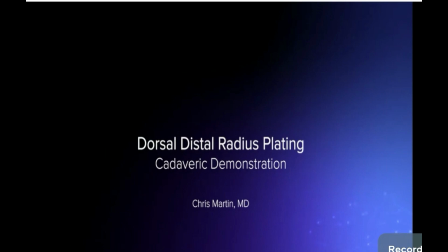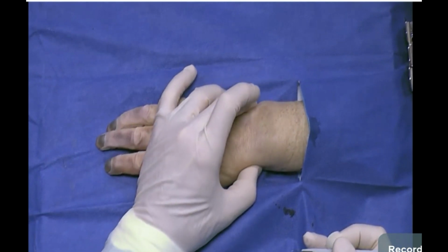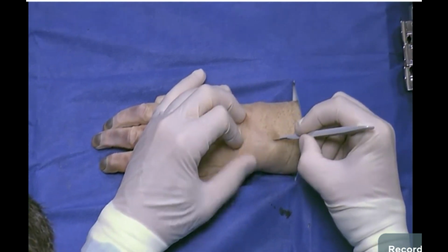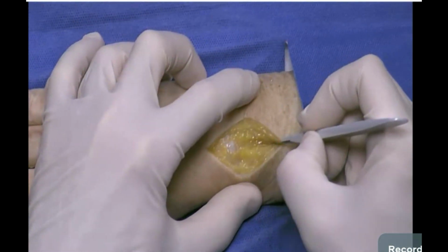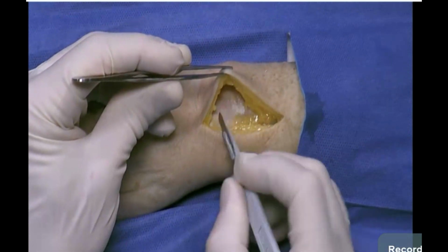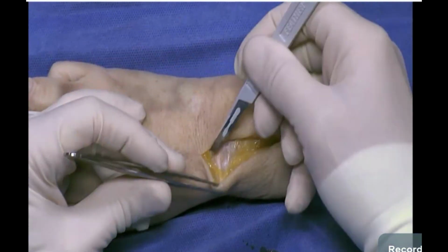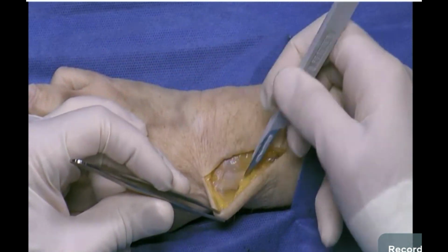So we're going to do a dorsal approach to the distal radius. The first landmark used is generally the styloid and Lister's tubercle. And we're going to come in straight over the carpus and just right down the center of the radius. And then dissection goes down to the retinaculum. This areolar tissue is used to elevate and expose the retinaculum widely, and taking care of looking for the superficial radial nerve on this side.